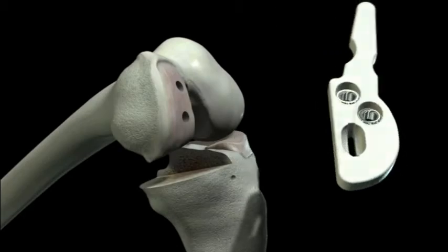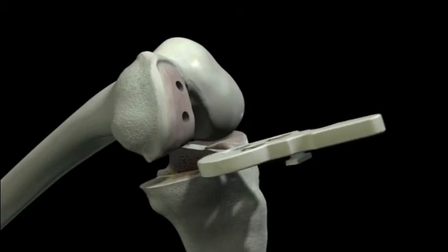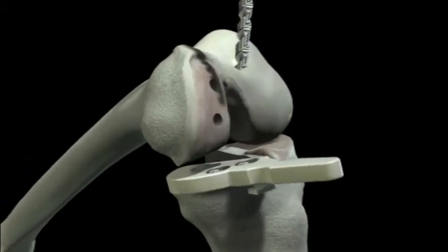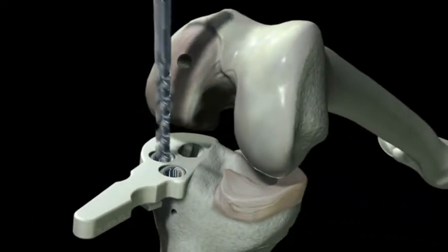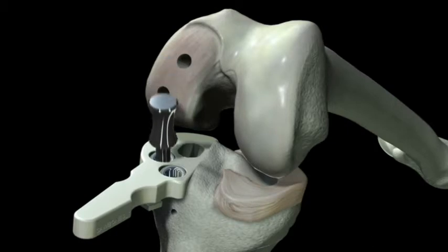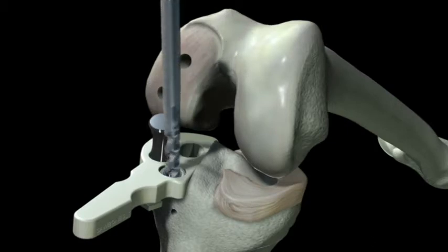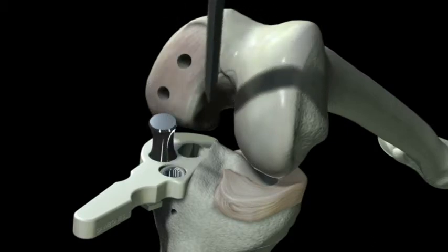Step 5: Tibial preparation. Place the tibial template on the tibia. Drill both holes but pin the posterior hole only to accommodate instruments for the upcoming fin hole preparation. Create the fin hole using a 5mm osteotome.